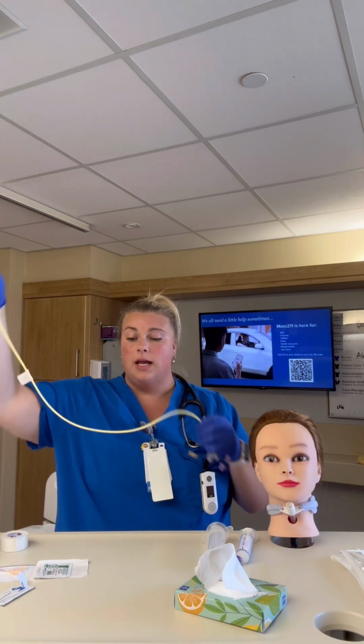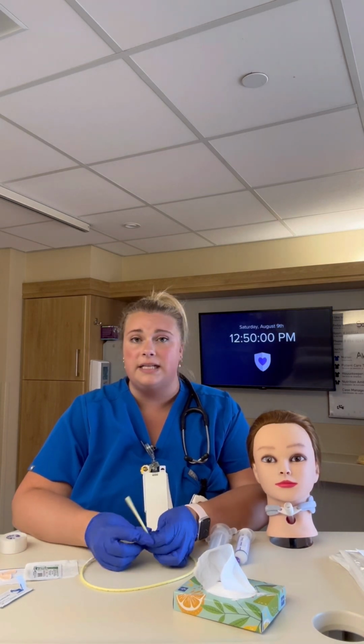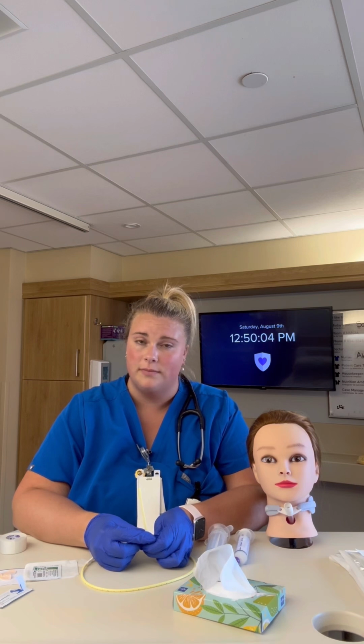So, next we're going to educate our patient on when we want them to take sips of water during the insertion. We want them to take sips of water when the NG tube has passed the nasopharynx and is right above the oropharynx. By having them swallow sips of water, we are helping them to advance and swallow the tube. It makes things a little bit easier on the patient because this is an uncomfortable procedure.